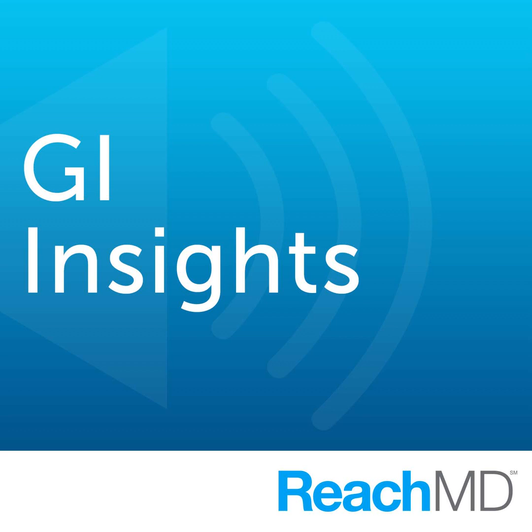So whenever we have a new monitoring tool or diagnostic tool, we want to compare it to the industry or standard practice tools and tests. I'll start by saying that the gold standard in IBD for diagnosis and assessment has been colonoscopy and increasingly biopsy assessment. But when we compare it to other cross-sectional imaging studies like CT enterography and MR enterography, the good news is to know that ultrasound has an equivalent or even better sensitivity, and after a patient's already diagnosed with IBD, specificity than CTE and MRE.